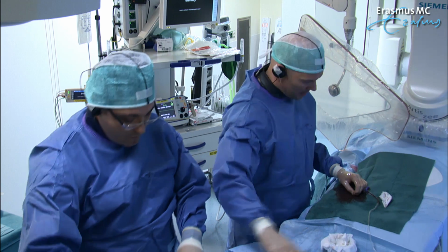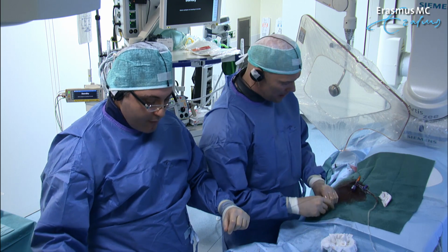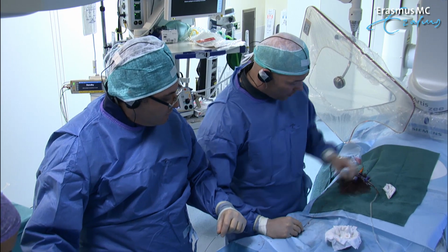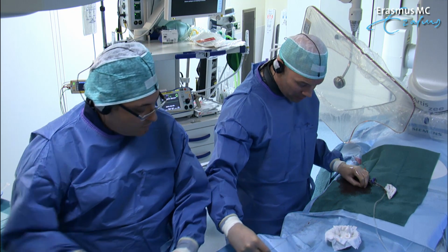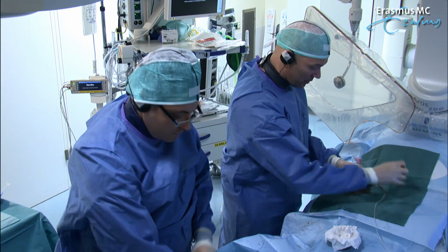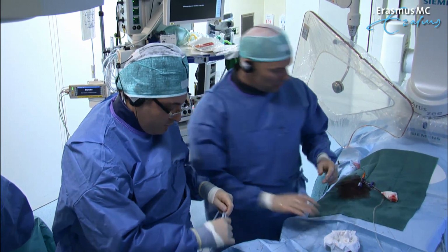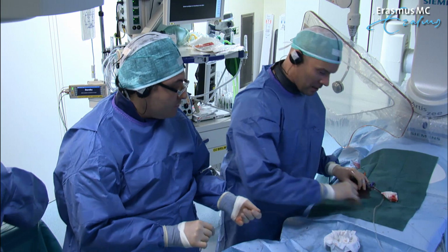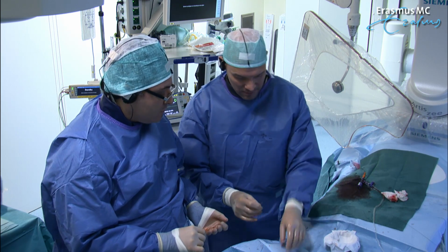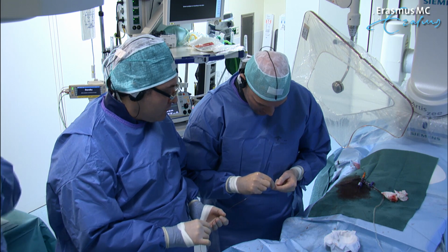Okay, so promising. So let's go back in now with the Navvus and assess our LAD. But we know now that we already have inflated a balloon in the left main as well, so this will influence our measurement. So there is no doubt we have to treat the left main. So now we're going to do the FFR to do the pullback from the LAD and see if we have an additional pressure drop at the level of the mid-LAD.